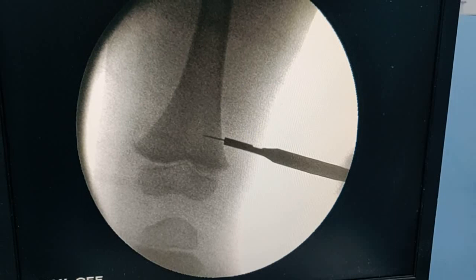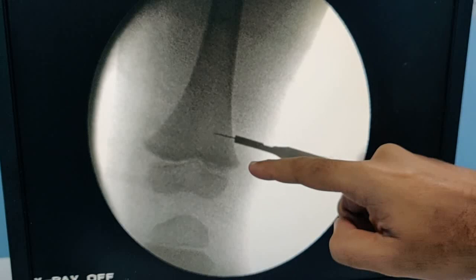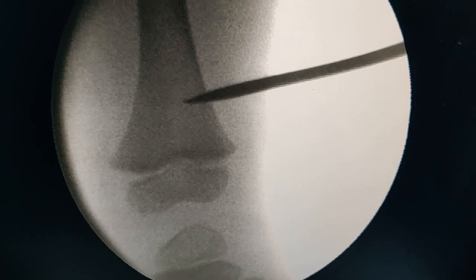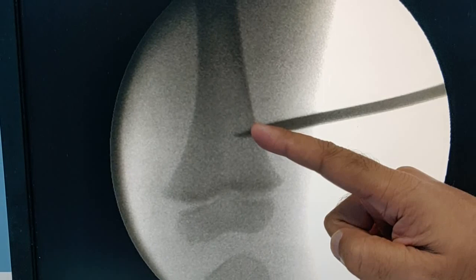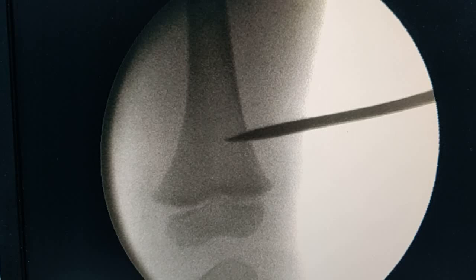Once your patient is prepped, draped, and ready, identify the site of insertion of the TENS nail. This is usually two centimeters before the level of the physis. Check it on X-ray and then make the stab hole so your incision is at the right place. One small tip when making your entry: go at 90 degrees to the bone first, then slowly become more and more vertical. That way you will not slip — if you start at an angle you keep skidding on the ridge and may struggle.